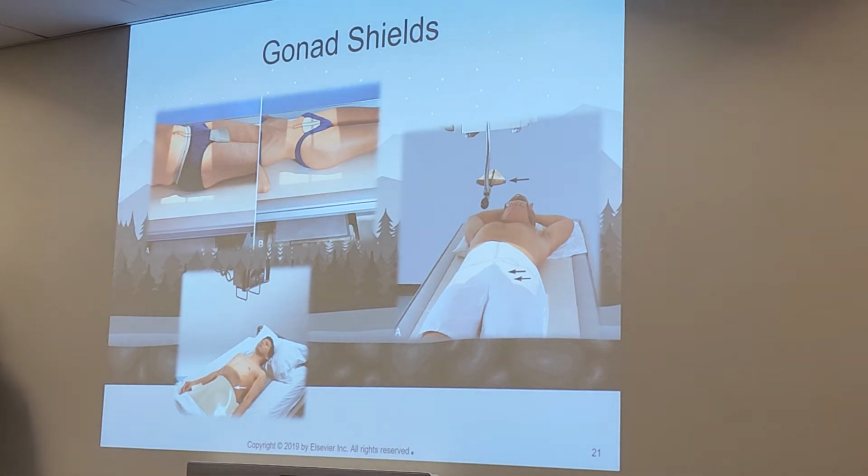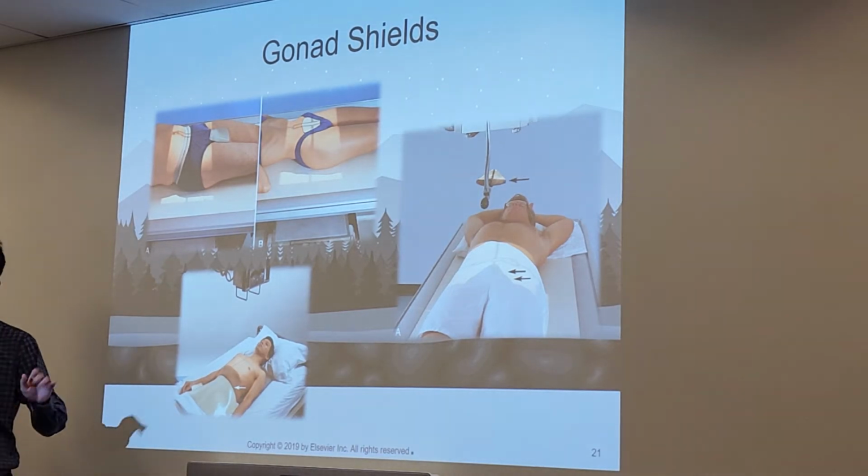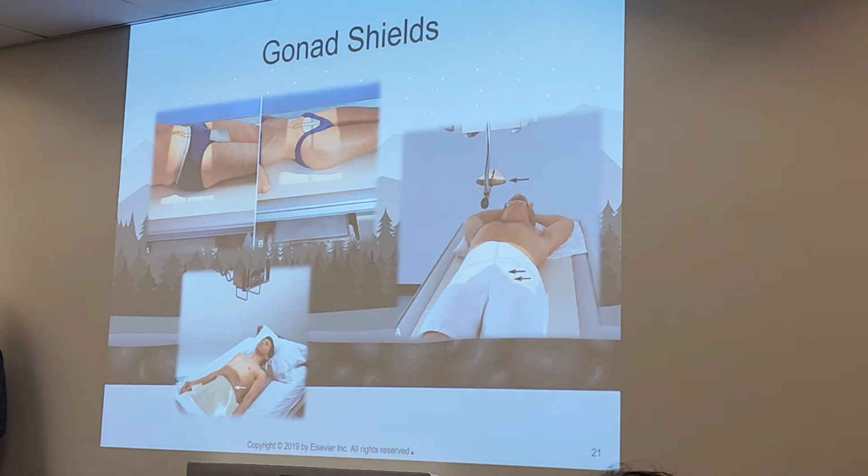Do not be like those techs. If you are working with such a tech and they are letting you position the patient, use a shield. Even if the tech says, no, you don't need to worry about that, use a shield. Okay? You are a student. As a student, your goal should be to build good habits during these 2 years. That way, these habits will carry over when you become a tech. Okay? As a tech, I can't control what you do, but as a student, I am telling you, make sure that you use a shield. Okay?